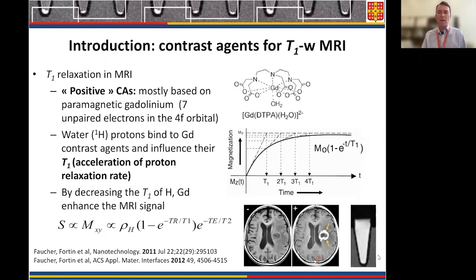So you can see that clearly this increase in MRI signal is due to the presence of gadolinium in the blood of the injected patient. And all of this can be predicted.